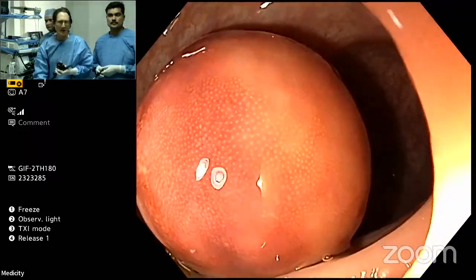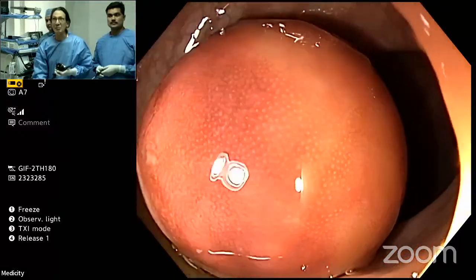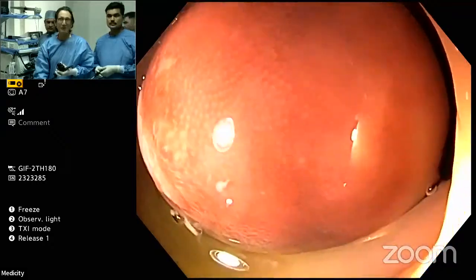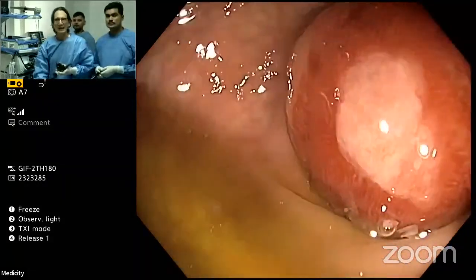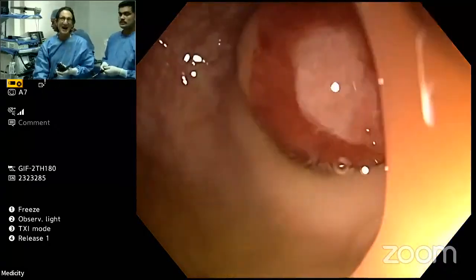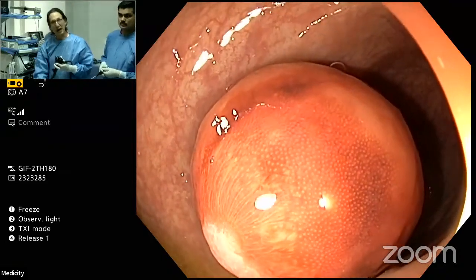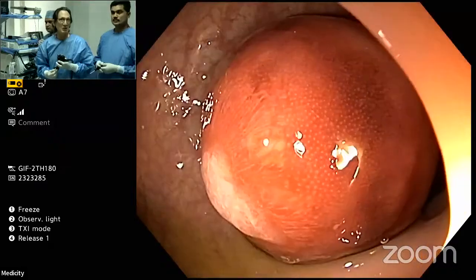Of course, everyone is infatuated with ESD and resections, third space, but I'm not sure that ESD is really the best option for this patient for something that's in fact not even pre-malignant. So what I'd like to show you today, in the spirit of innovation, the I, is a different way that you can remove this using a double channel scope, deploying 2 instruments through each of the channels.